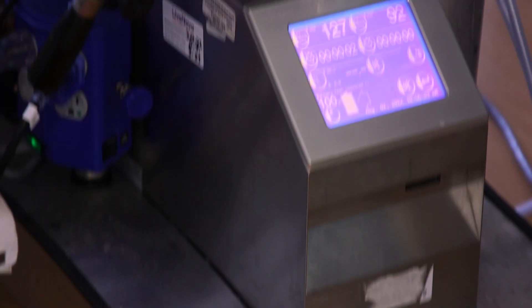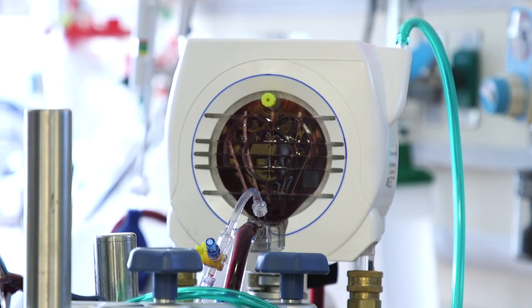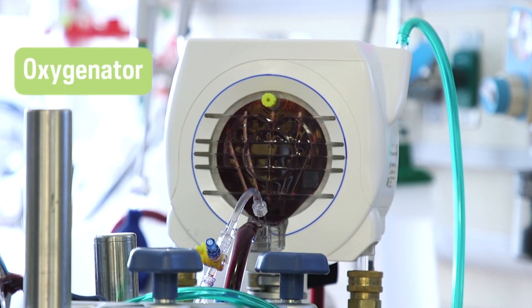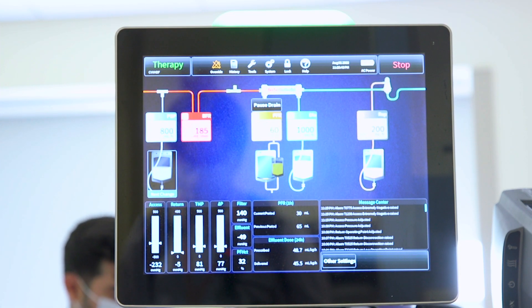ECMO is when a person's lungs or heart are not working and we're able to take blood from their body, oxygenate it outside of their body, and put it back in. This is our oxygenator. We're functioning as a lung or a heart, depending on what type of ECMO it is, to help the person get oxygen to where they need to get.